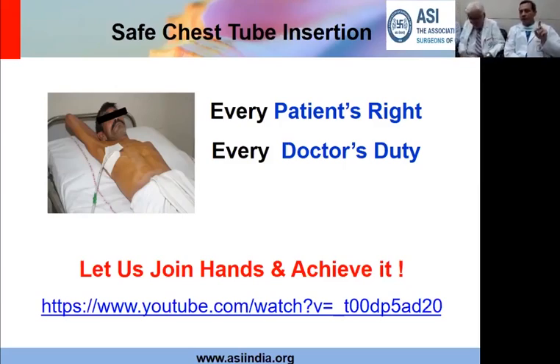Just one addition. Antibiotic is not for chest tube site infection. These people will be getting antibiotics for concomitant associated problems like chest infection, abdominal infection, bone injuries or other injuries. Those are more important. So I think it's a very clear message that you have given, that the mere presence of a chest tube is not an indication for antimicrobial therapy. There has to be some other condition or reason for it. Yeah, that's right, but having ensured that you've taken aseptic precautions. Absolutely.